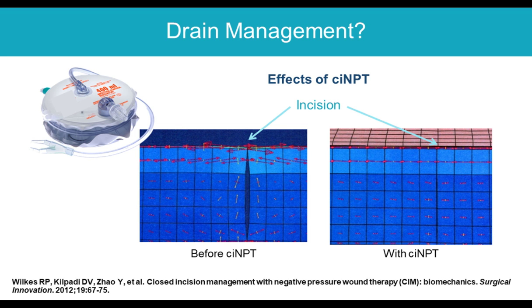What about drains? I think drains are something that some of us use, some of us don't use. I use them sparingly, but when I use them, I think about the drains managing the deep space, and I think about the negative pressure dressings as managing the superficial and subcutaneous spaces. So I think of these as having different purposes. I don't think that the negative pressure dressing does away with what a drain would have done.